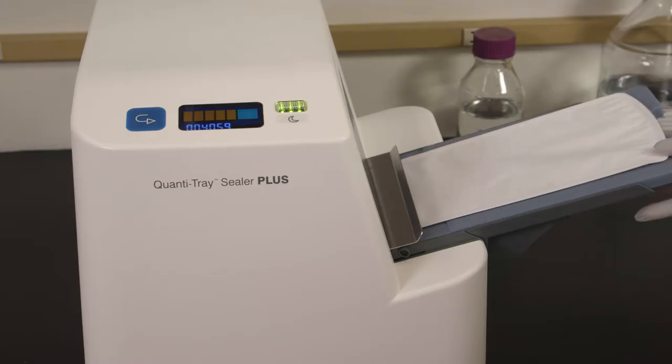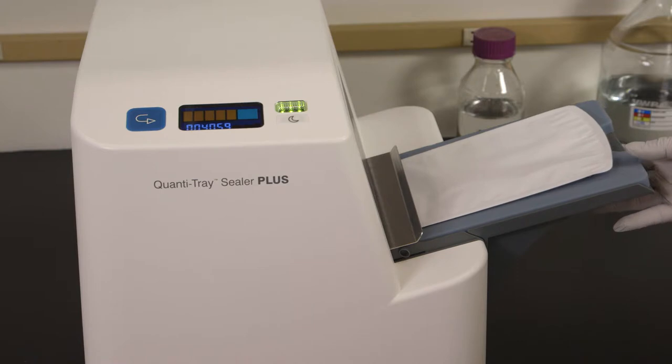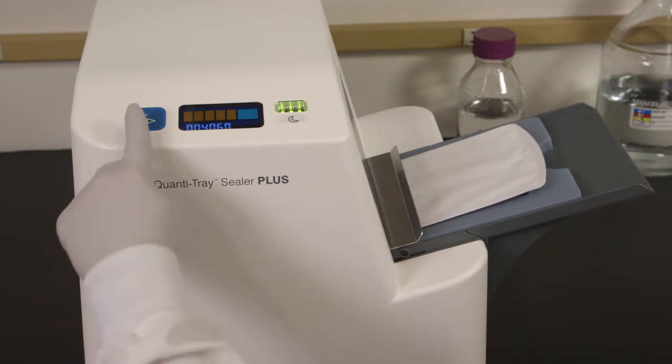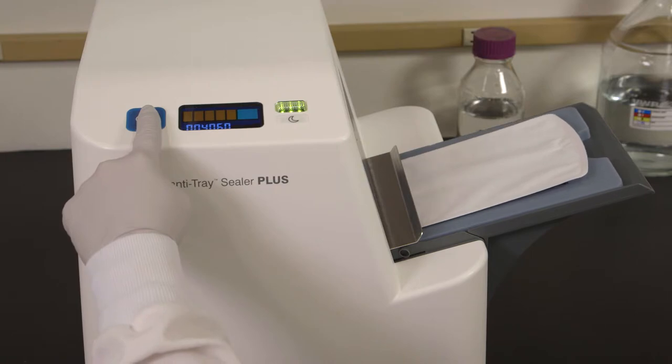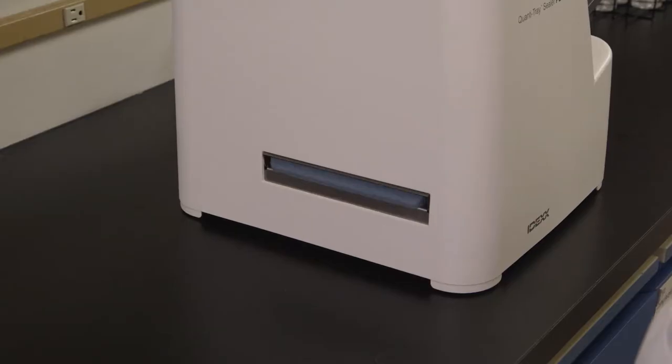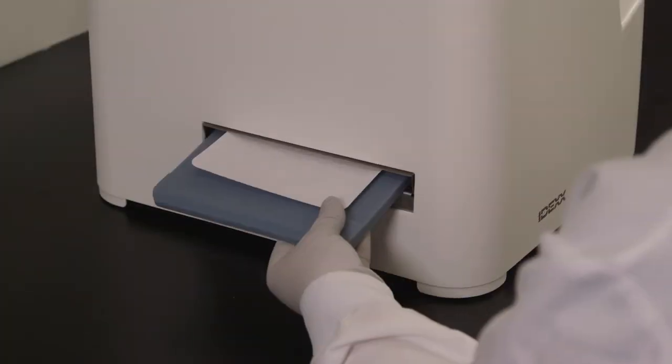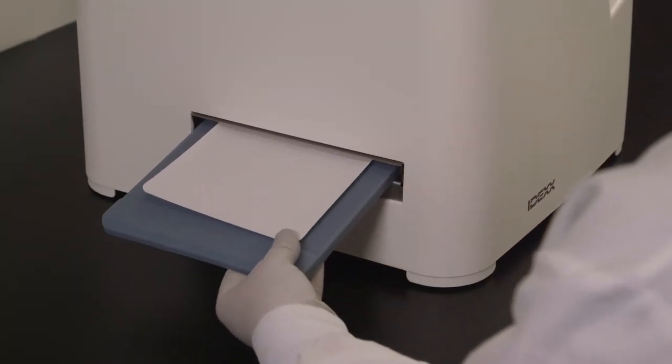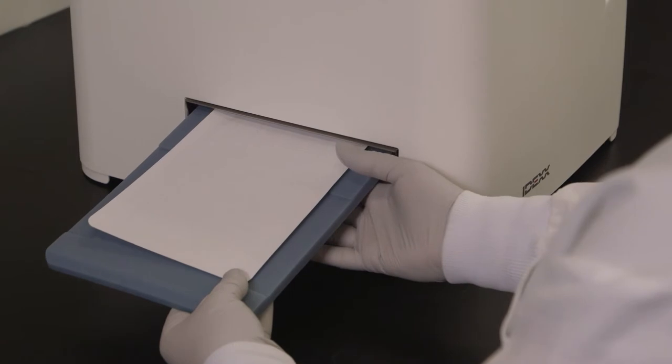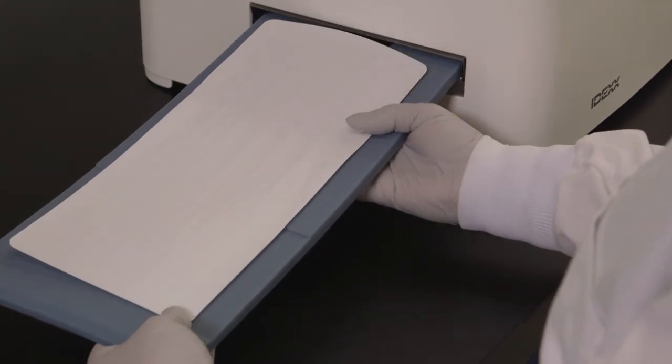If you need to reverse the motor, press and hold the reverse button. However, do not reverse the motor if the rubber insert is completely inside the sealer. The sealer distributes the sample mixture into the Quantitray LEG-ALERT wells, seals the wells, and partially ejects the sealed tray. Remove the rubber insert and tray from the sealer.